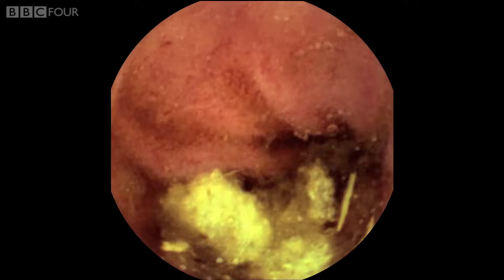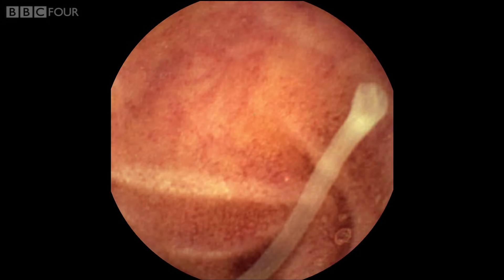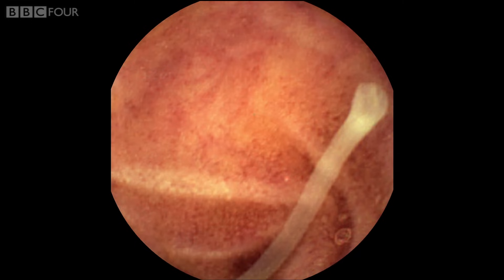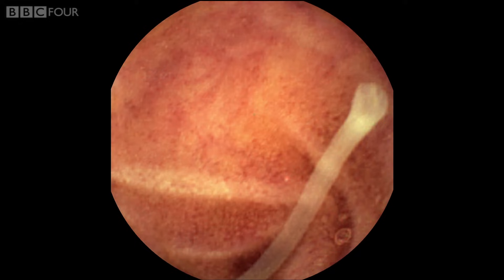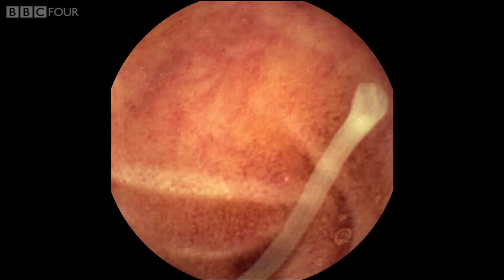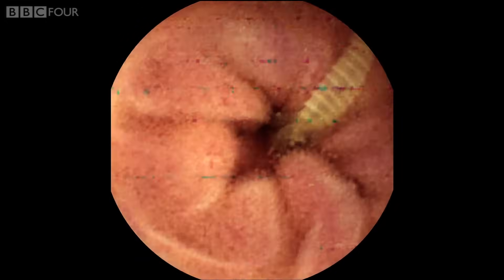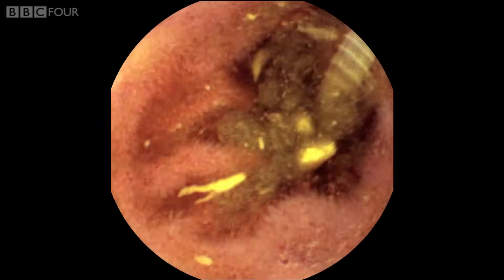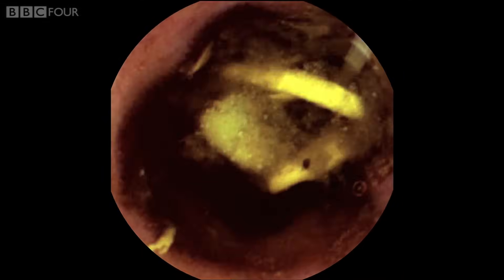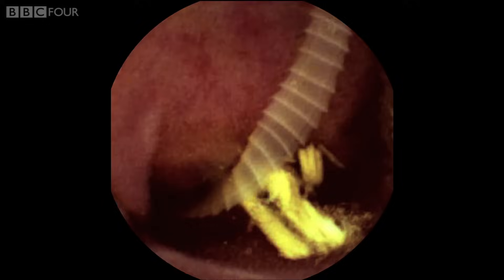We're now moving to the third worm. Here we can see the actual very front end of the worm. This is called the scolex, and we can actually see there are four suckers. These suckers grasp onto the wall of the intestine and hold the worm in place. Other tapeworms might have some hooks around the top as well, which they anchor into the intestinal wall. These worms don't have any intestine — they simply absorb nutrients across the body walls; they don't actually eat anything. They absorb across the body wall just as the intestine absorbs food. In most cases, the worms themselves don't cause a huge problem to the host. Generally speaking, the intestine is full of nutritional material which is sufficient for both the host and the parasite.